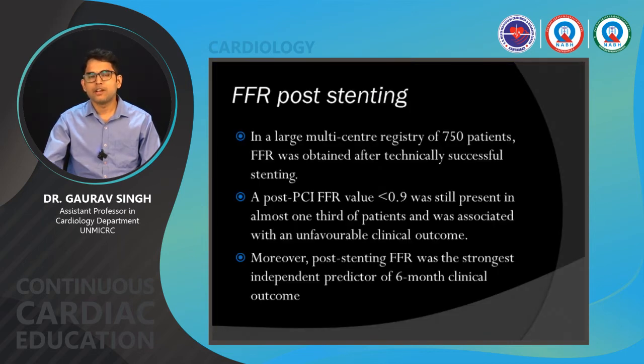FFR post-stenting: we have deployed the stent, patient is stable. Then is there a place for FFR post-stenting also? So in a large multi-center registry of approximately 750 patients, FFR was obtained after technically successful stenting. A post-PCI FFR value less than 0.9 was still present in almost 1/3 of the patients and was associated with unfavorable clinical outcome. Moreover, post-stenting FFR was the strongest independent predictor of 6-month clinical outcome. So if you get a value of more than 0.9, it's good post-PCI.